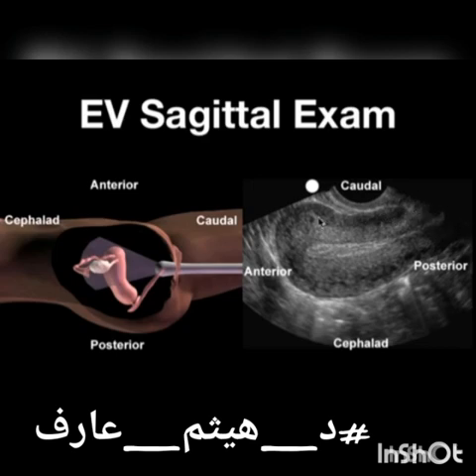Here you get a nice view of this anteverted uterus. Here you've got the medium level echogenicity of the myometrium. Here you've got the central endometrial cavity here.